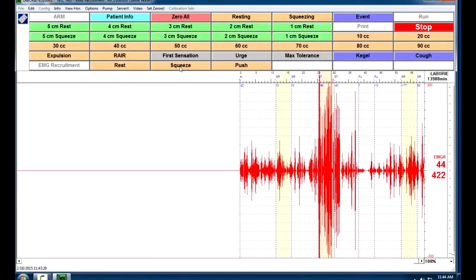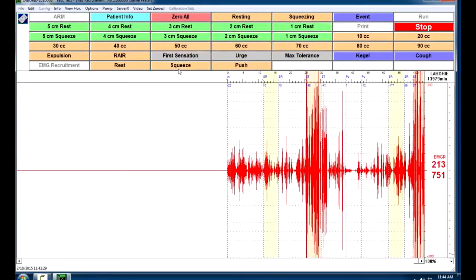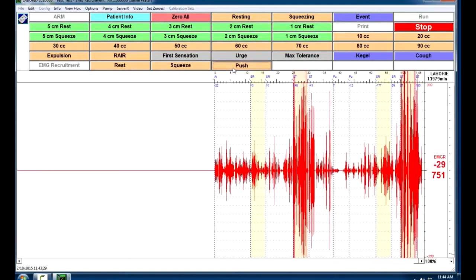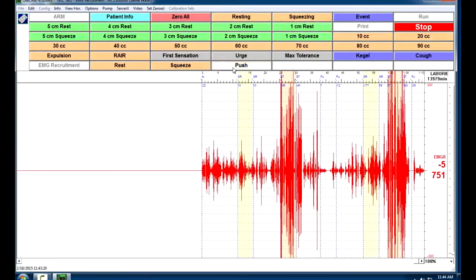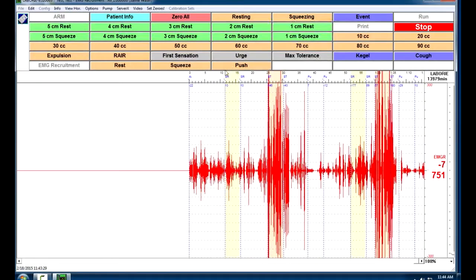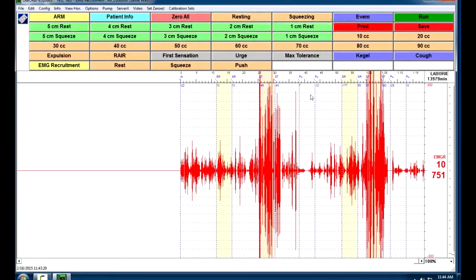And then again, have the patient bear down and squeeze, squeezing their anus like they're trying to keep gas from expelling, and then to push like they're trying to have a bowel movement. Again, you should see a relaxation of the EMG activity. Then we'll click the stop button.